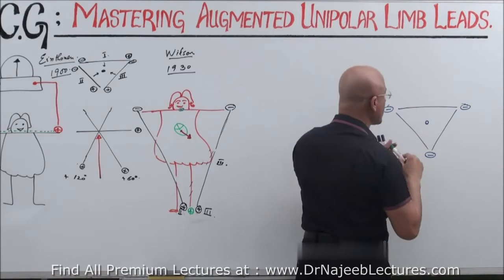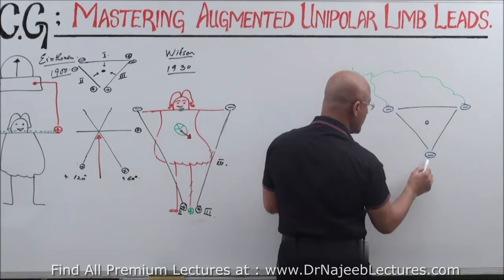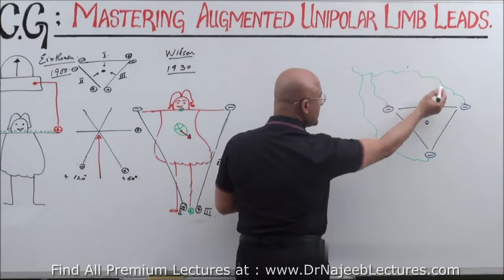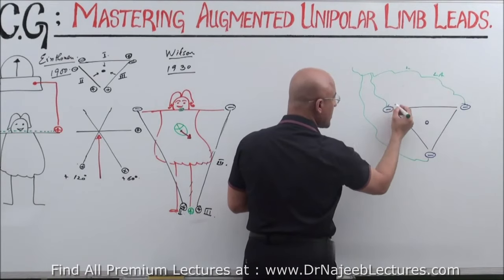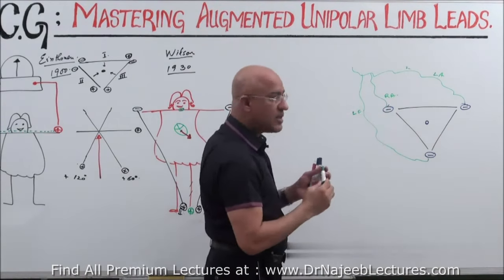These are electrodes, these are the wires of the electrodes. What are these? Wires of the electrode. Now, which wire is which? This is the right arm wire, this is the left arm wire, this is the left foot or leg wire.